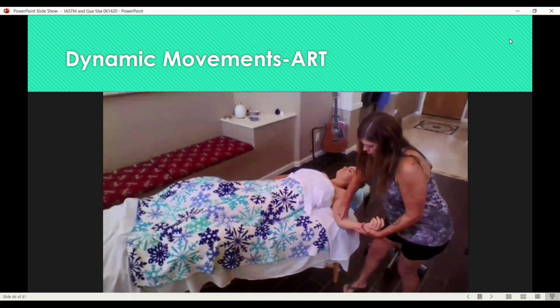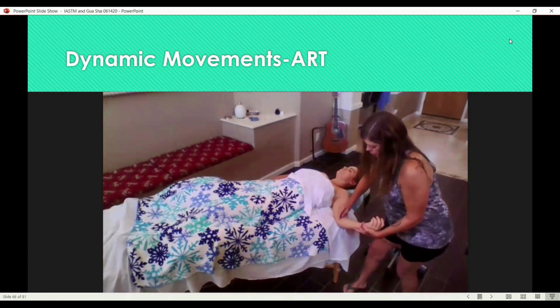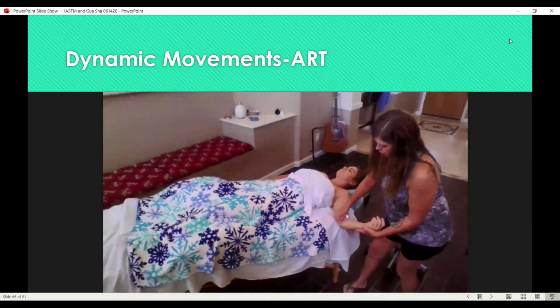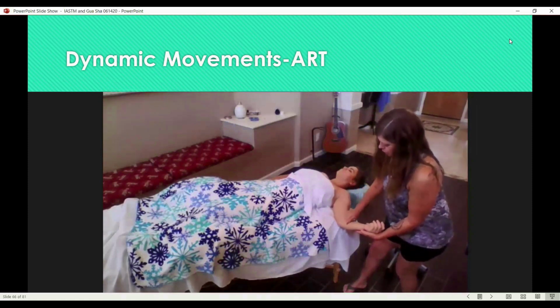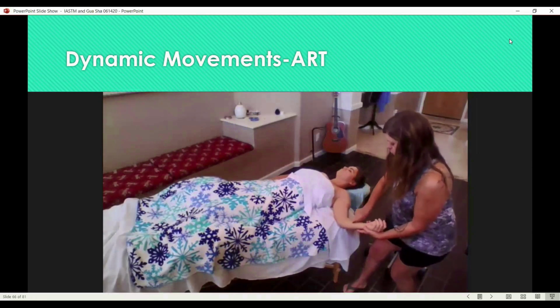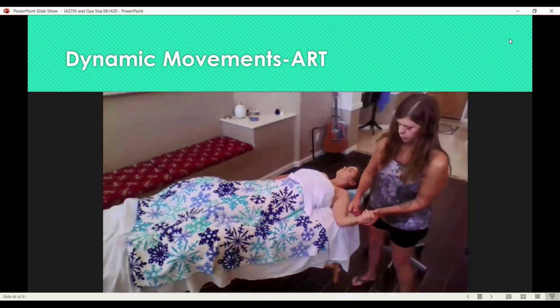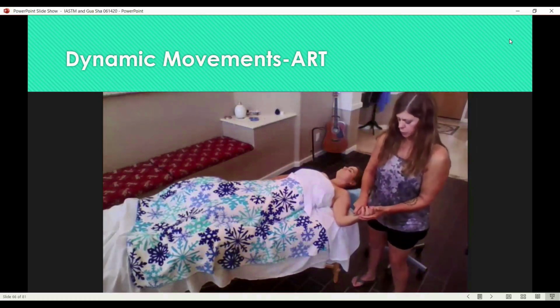And so we've worked above and below, and now we're working through. And smoothing it out. Some nice sweeping strokes towards the end. She's really tight here, so I'm ending with a lengthening or inhibiting the muscle. I guess I found one last adhesion in there. I go back for it. You'll find stuff. You'll assess with that tool.